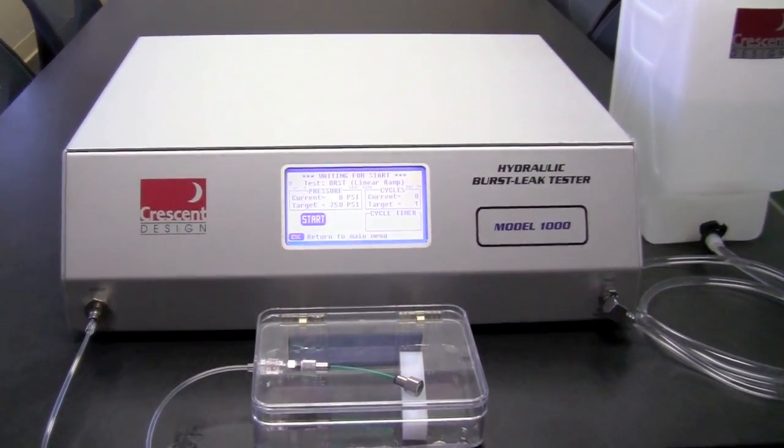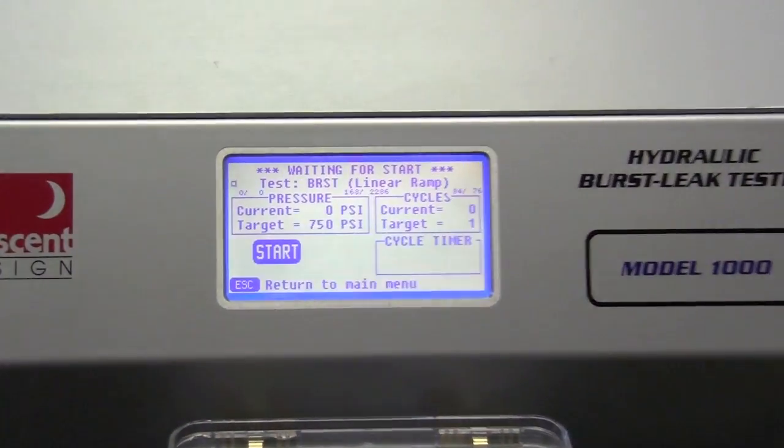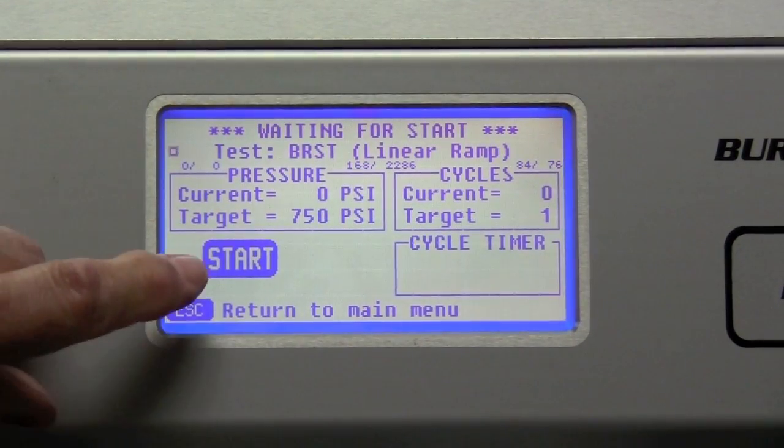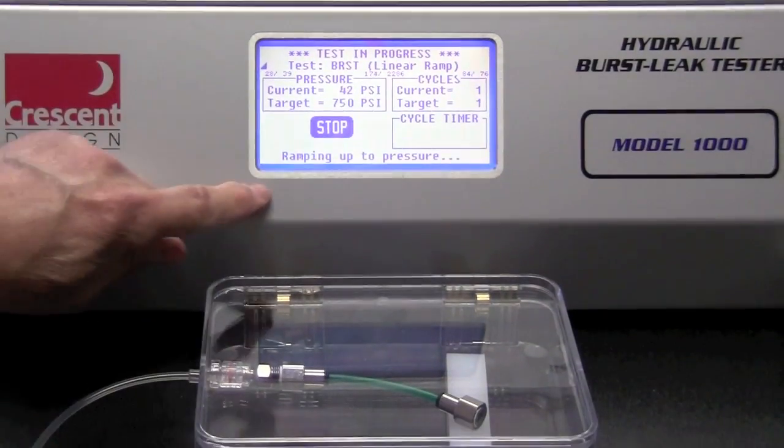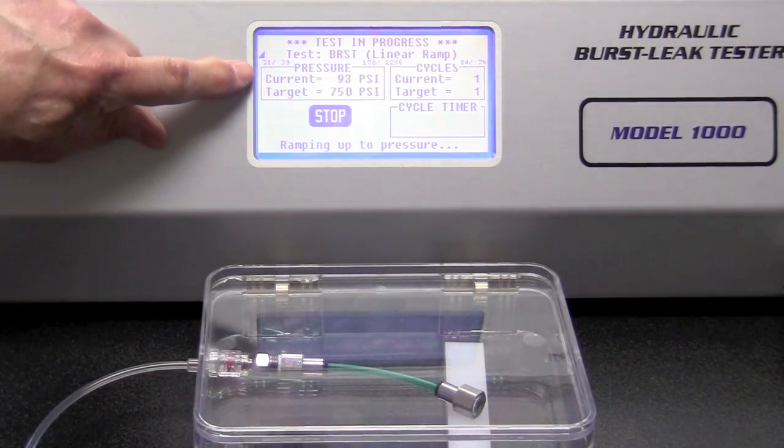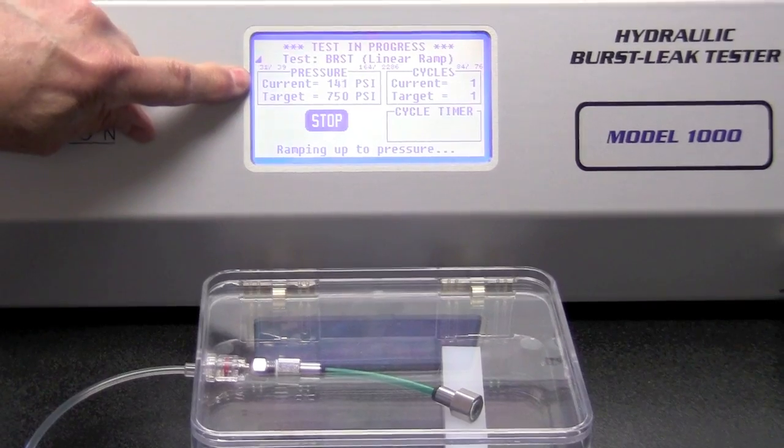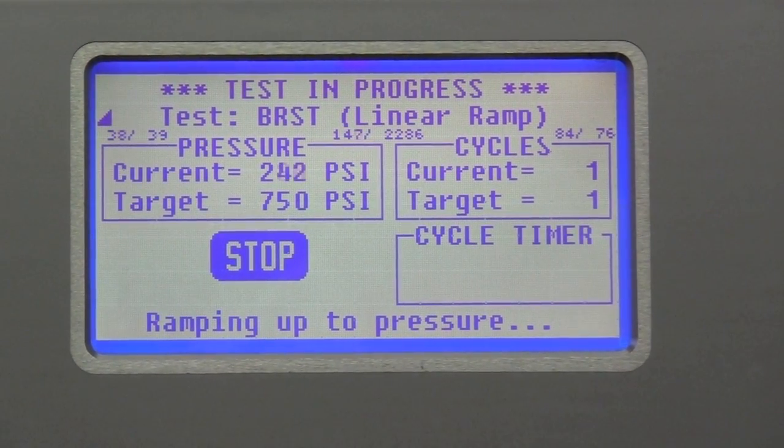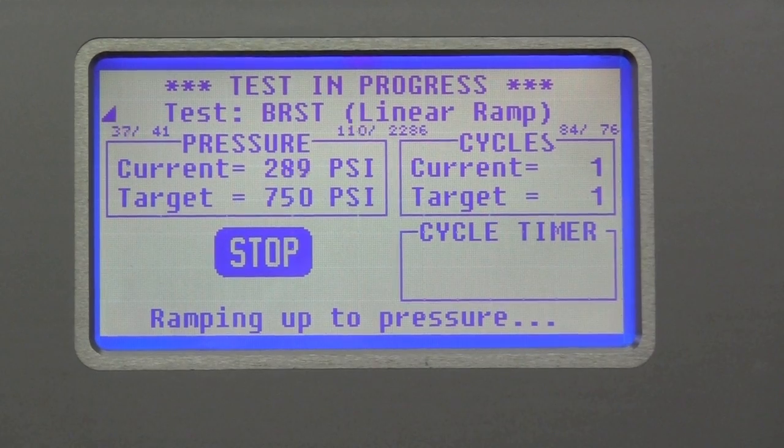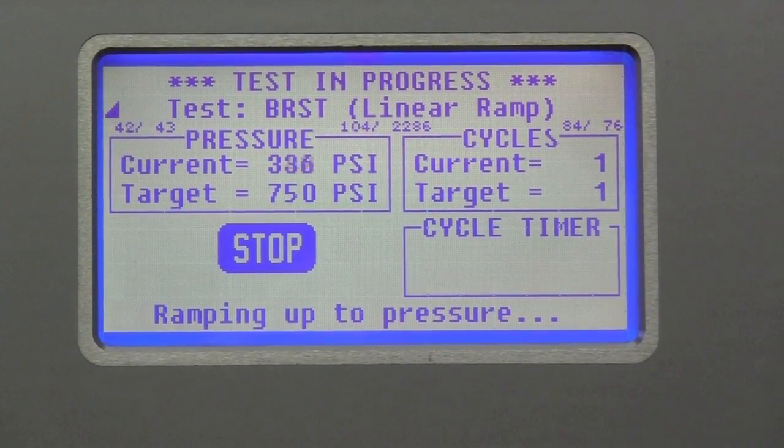And I'm going to put this in this container so that I don't get wet. And now we're ready to start the test. So I'm going to push the start button. And you can see that it's saying ramping up to pressure. You'll notice the current pressure is increasing. I believe this tubing will rupture somewhere around 550, 520 PSI.